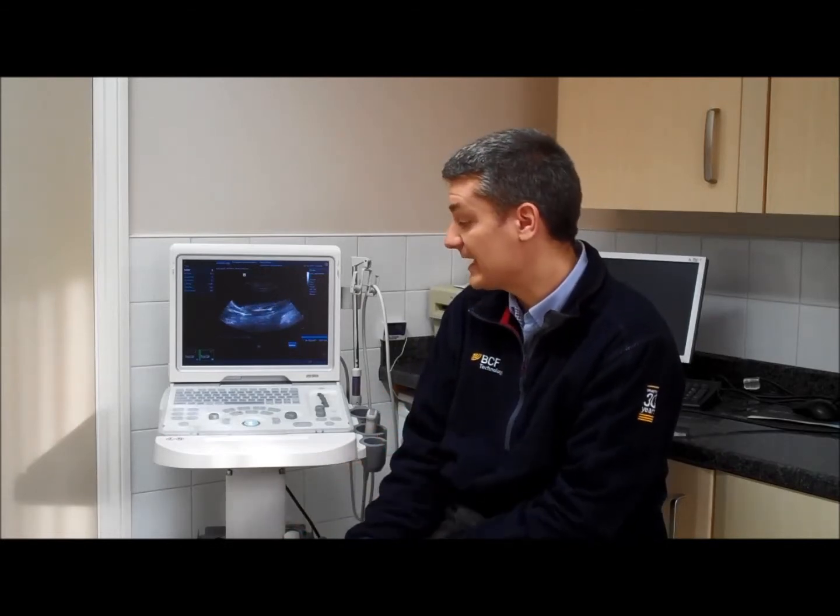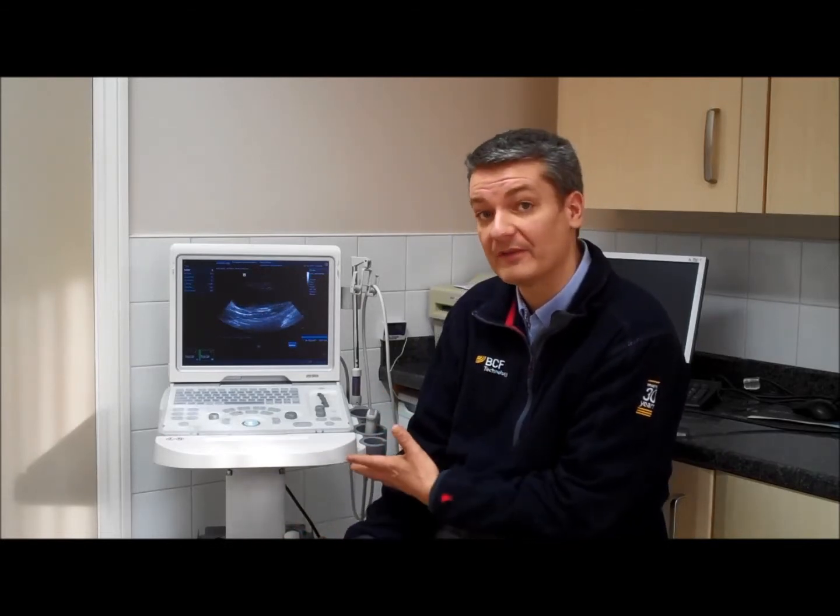This scanner, as you can see, is either portable or you can have it on a stand. This one here is on the optional stand, which makes it easy to wheel around the practice.